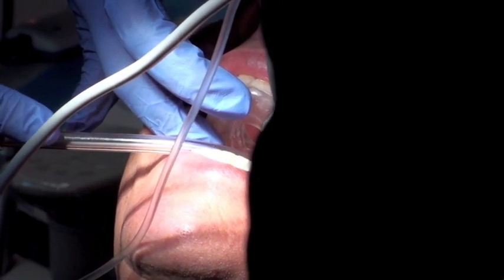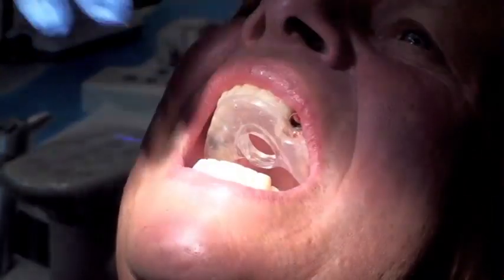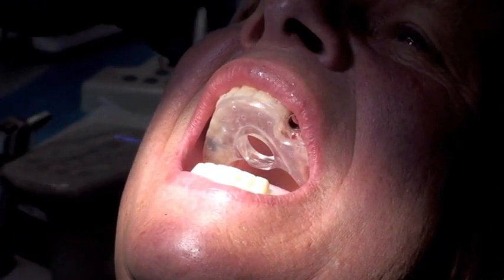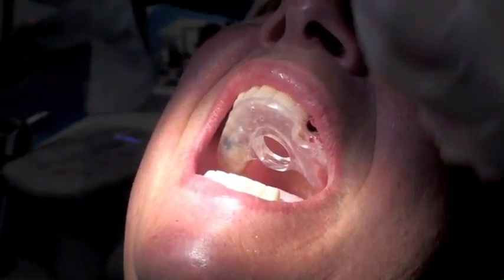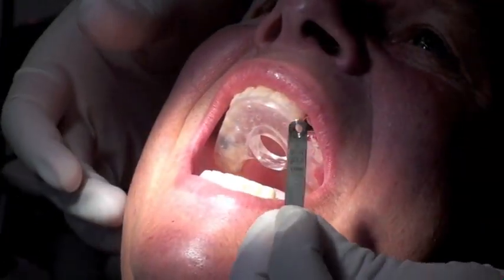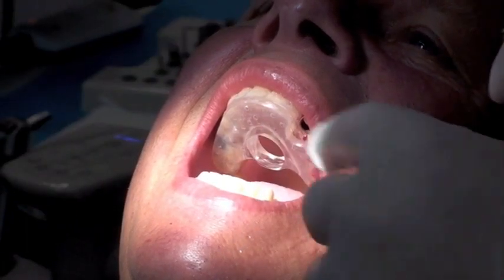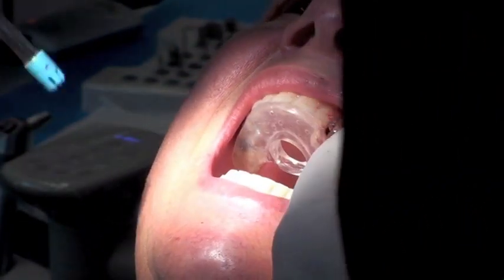Now this surgery took me a total of 13 minutes, but what I've done with this video clip is abbreviate this version just for time's sake. So after the 2.0 twist drill, we're going to follow it up with the next surgical key guide. In this case, it's going to be a 3.2 by 1 millimeter key. This allows us to bump up to the next osteotomy, yet still be completely guided.